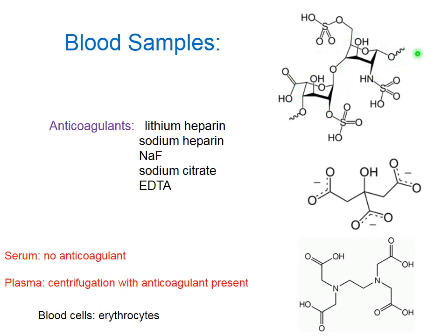It can be lithium heparin, mainly for cases when you want to analyze for alkali metals like sodium. Most common is sodium heparin. Then more exotic: sodium fluoride, sodium citrate, or EDTA. Sometimes a combination of these two.